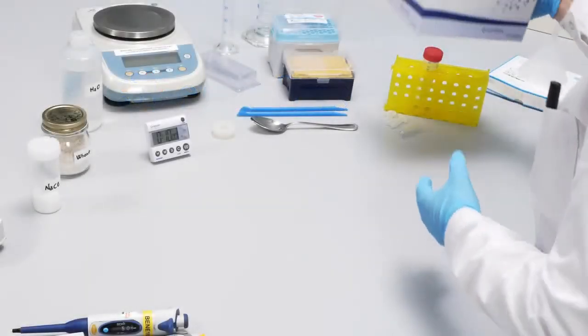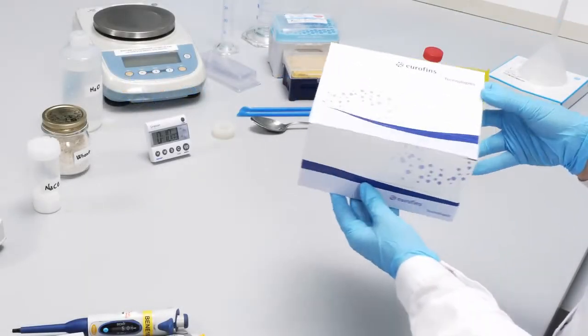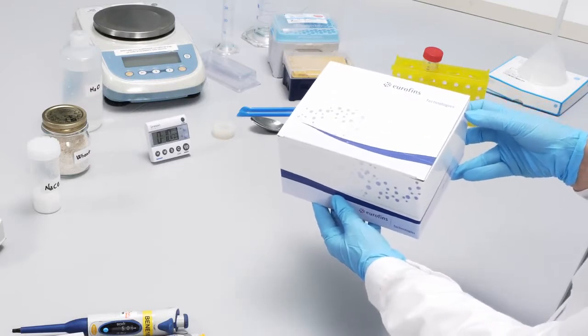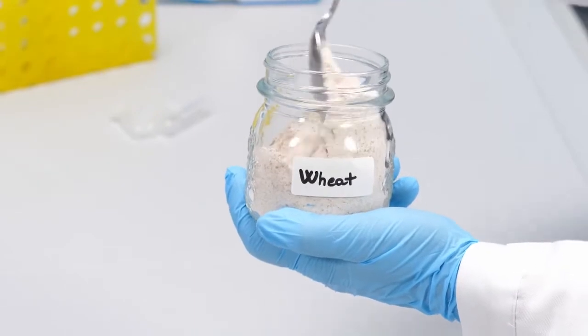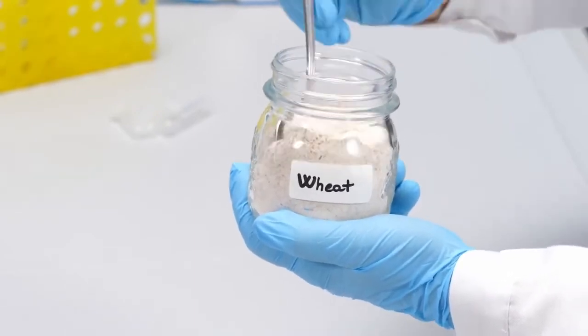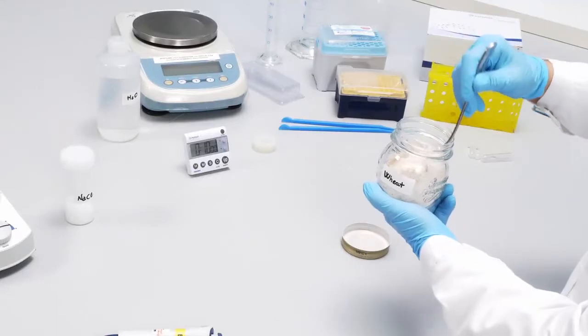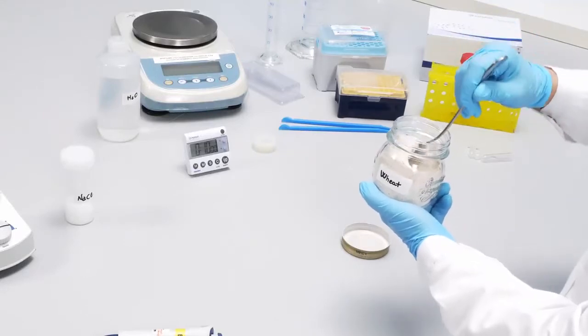H2DON is a sensitive and accurate enzyme immunoassay for the detection of deoxynivalenol in several vegetal matrixes like wheat, durum wheat, maize, barley, oats, rice, rye, feed, and feed ingredients.